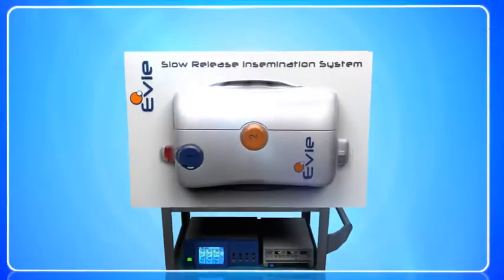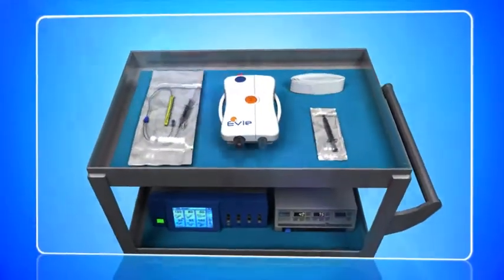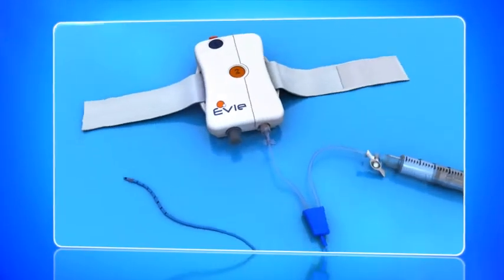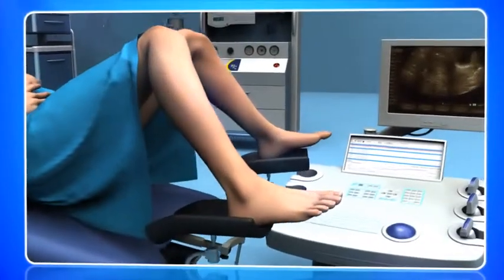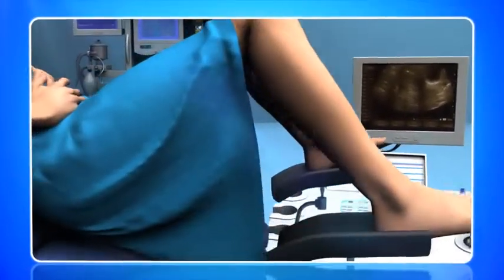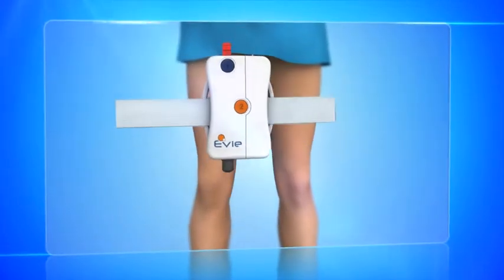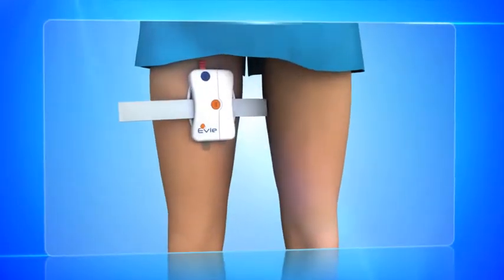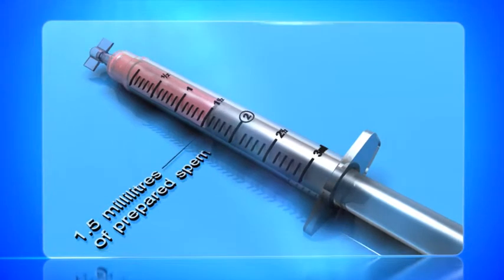The EVIE SRI system is an easy-to-use, single-use ambulatory device. To use EVIE, following preparation of the patient, firstly attach the leg strap to the EVIE device and then attach to the patient's right leg. Fill the supplied insemination syringe with 1.5 milliliters of prepared sperm.